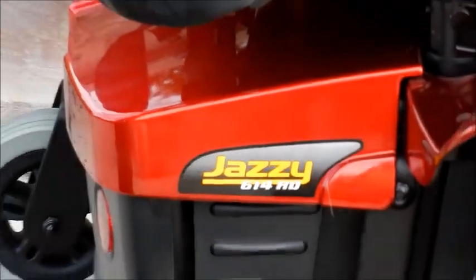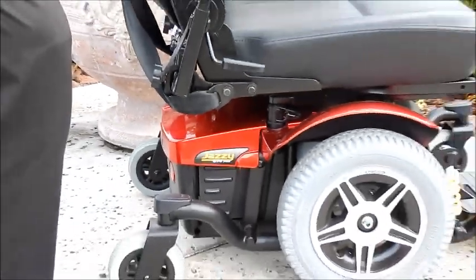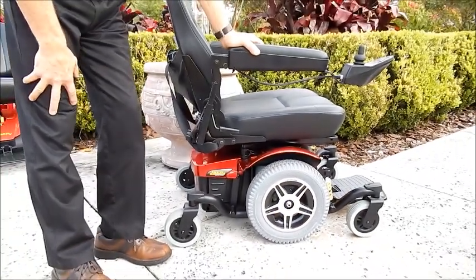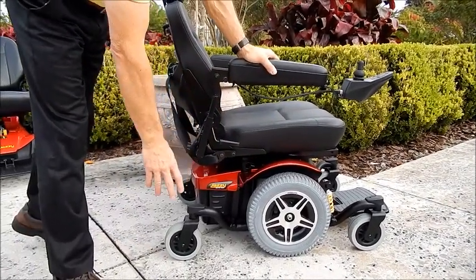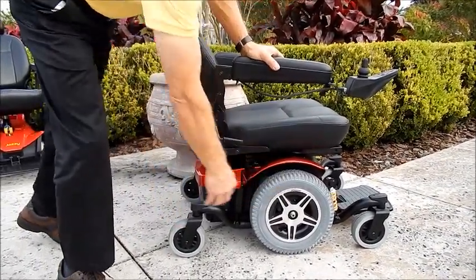This is a 614 HD. This is a heavy-duty power chair. It'll carry up to 450 pounds. This chair has six wheels on the ground. These wheels are solid, non-marking wheels.